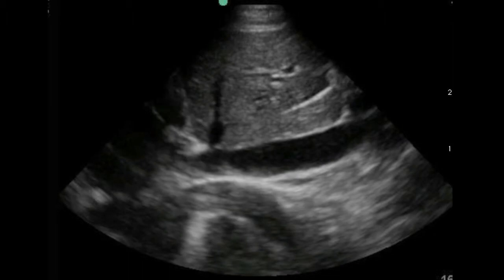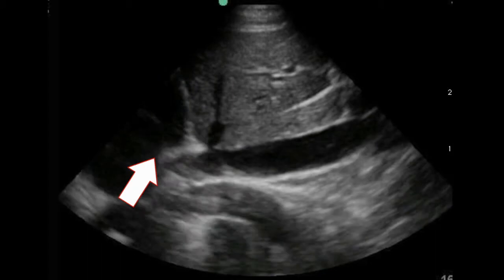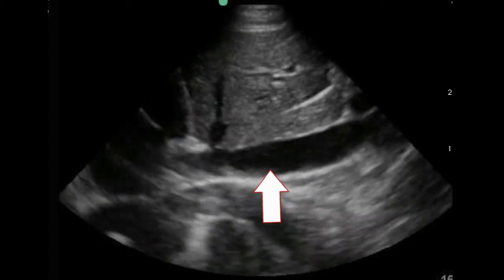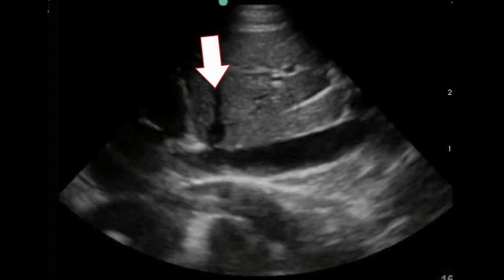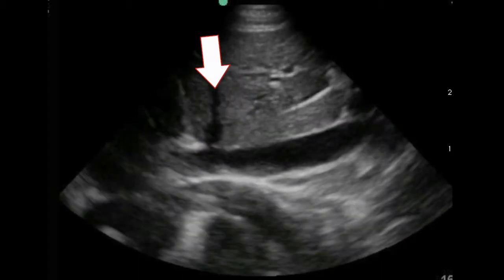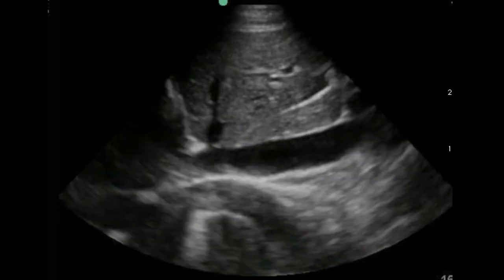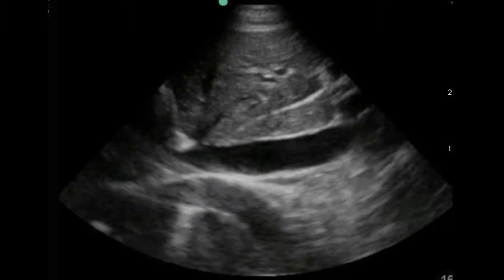Unlike the aorta, the inferior vena cava leads directly into the heart, which you can see moving here. Here is the right atrium. Here is the vena cava. And here you can see intrahepatic veins draining into the inferior vena cava. Most importantly, you know it's the inferior vena cava because it's draining directly into the heart.